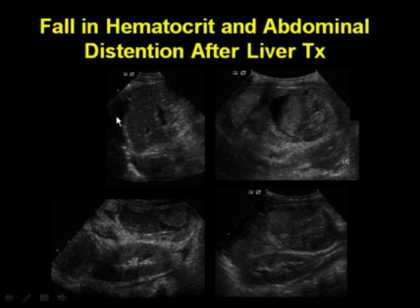We see that there's some fluid in the chest and also at the tip of the liver. Here's a sagittal view of the right kidney, and we see that there is an abnormal collection of material in Morrison's pouch between the liver and the upper pole of the kidney.